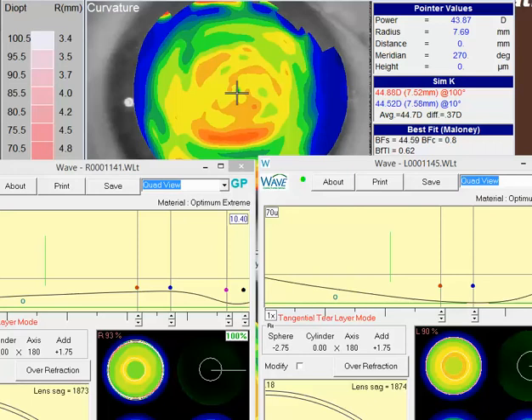I see from your clinical request that you're struggling a little bit with this bifocal set of contact lenses, and if I understand correctly, there's three basic questions that you're concerned about. One is the edge design regarding edge lift, and your current lenses apparently are fitting rather tight. Secondly, the concern about the lens getting filmy. And third is the position of the bifocal.